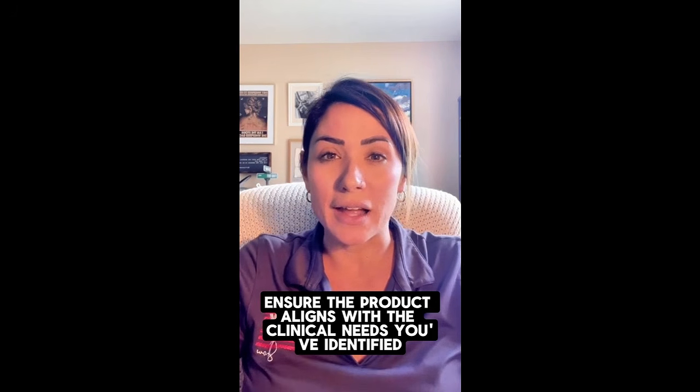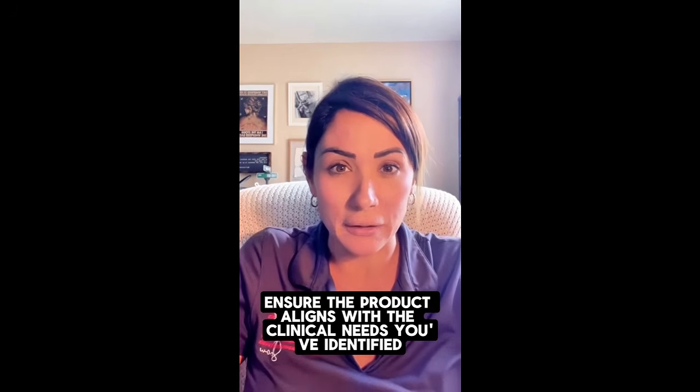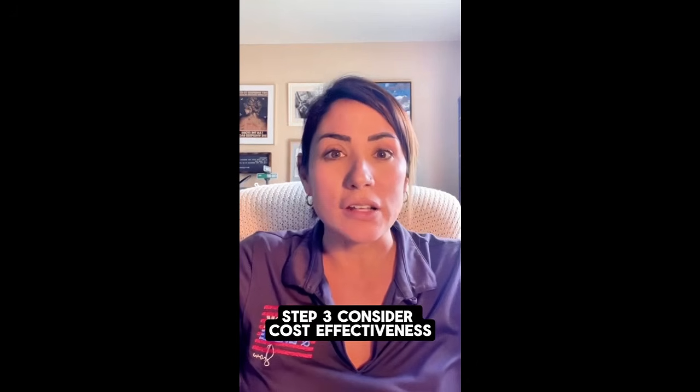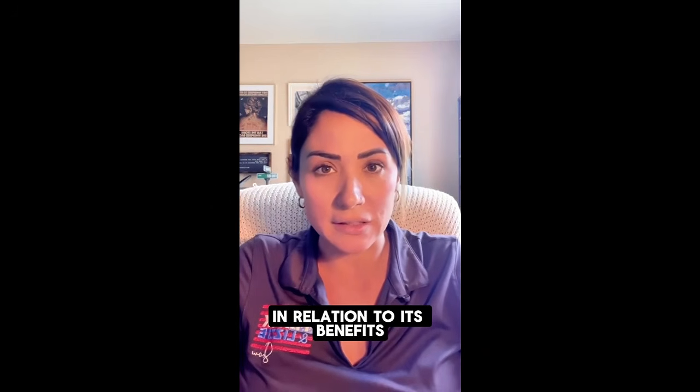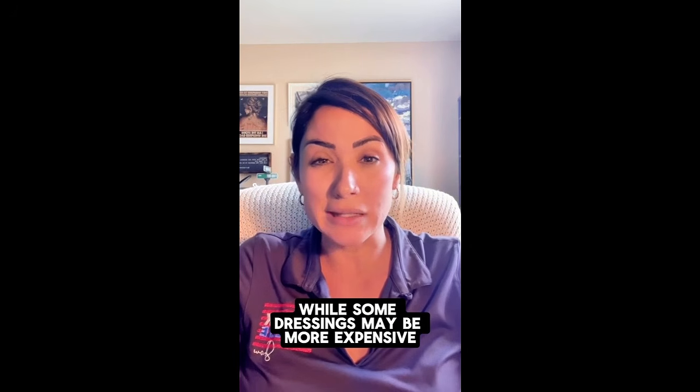Ensure the product aligns with the clinical needs you've identified. Step 3, consider cost effectiveness. You want to evaluate the cost of each brand in relation to its benefits. While some dressings may be more expensive, they may have longer wear time.